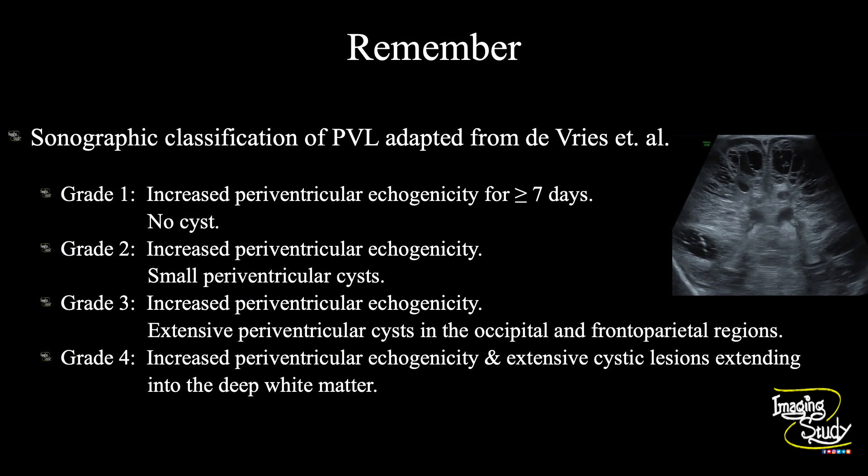Now, periventricular leukomalacia has 4 grades. In grade 1, there will be increased periventricular echogenicity only. In grade 2, you will get small periventricular cysts also. In grade 3, there will be extensive periventricular cystic spaces involving the occipital and frontoparietal regions. In grade 4, these cystic spaces will also involve the deep white matter, like you see in this picture.